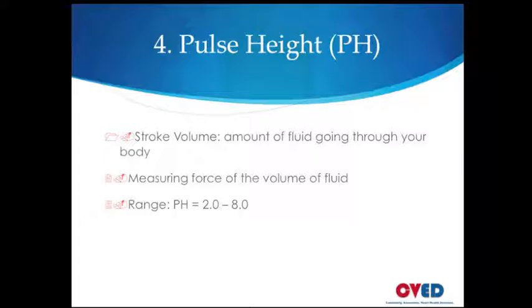You really don't need that much water as long as you're getting the electrolytes. So that could be the reason why you'd be coming out under 2.0 in a pulse height. Now, if it's over 8.0, there are different reasons for that as well.